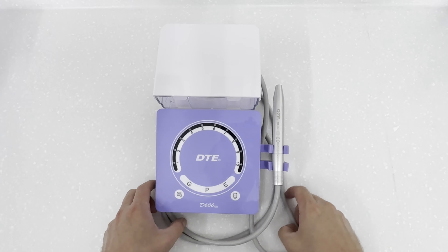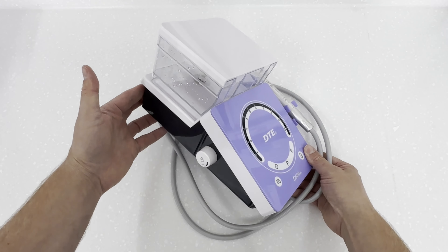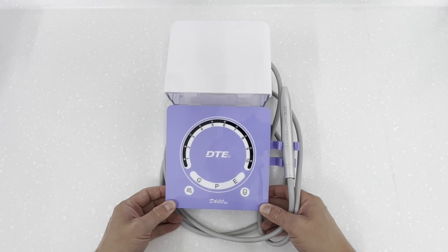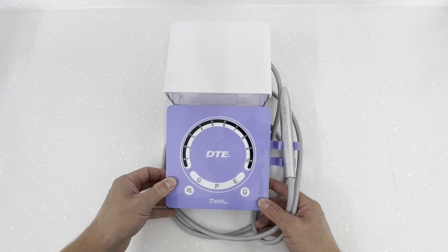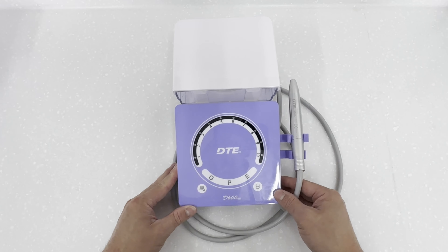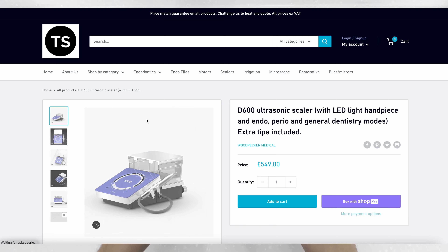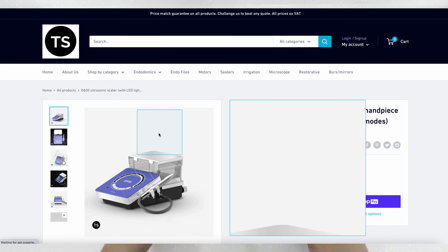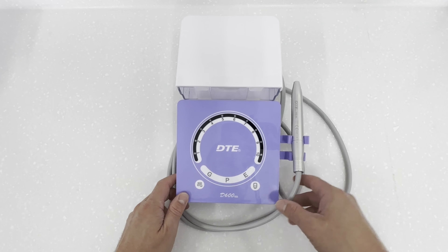Welcome to this video about the D600 ultrasonic scaler. Over the next 20 minutes or so I'm going to show you that this is a very versatile piece of equipment. It's so well built that it probably resists a nuclear attack. This unit was given to me by Daniel at Tooth Saver Surfing UK — head over there for all your endodontic needs, fantastic website and customer service. This unit retails for £549.